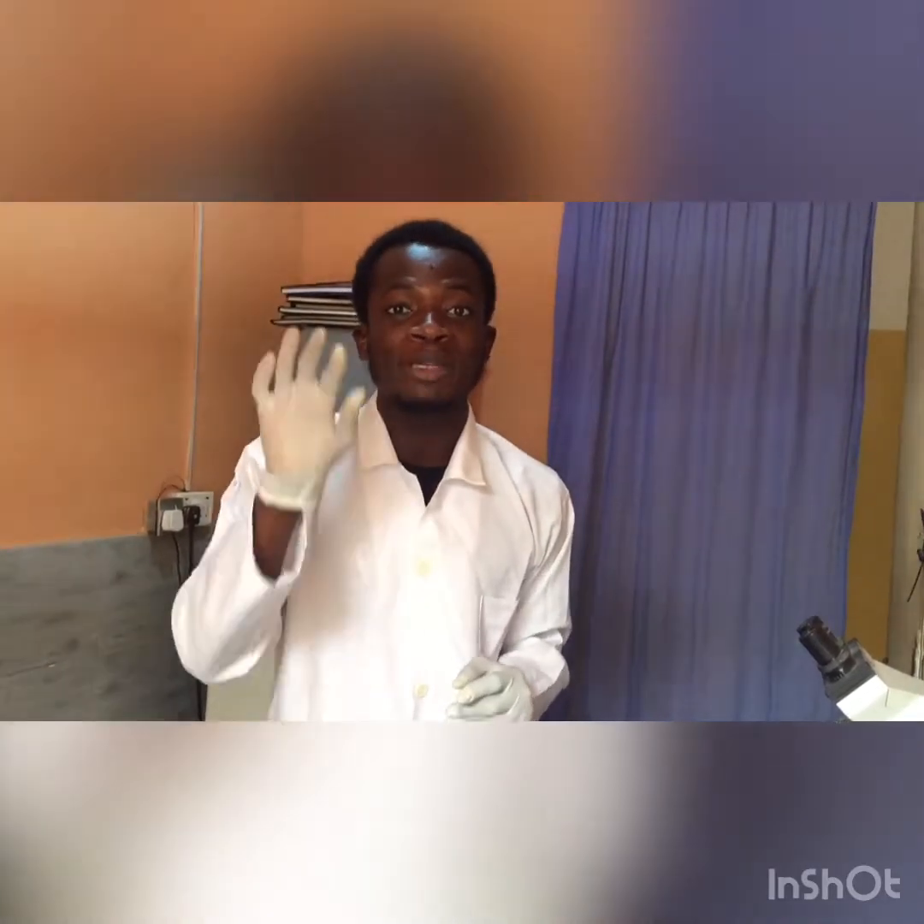Hello everyone, my name is Kristen Jones and in this video I'm going to be showing you how to detect malaria parasites using the microscopic method.